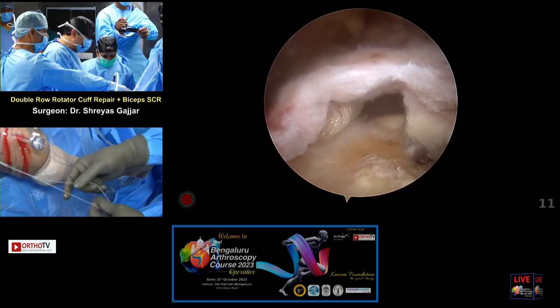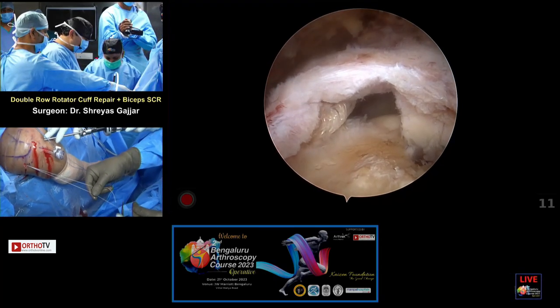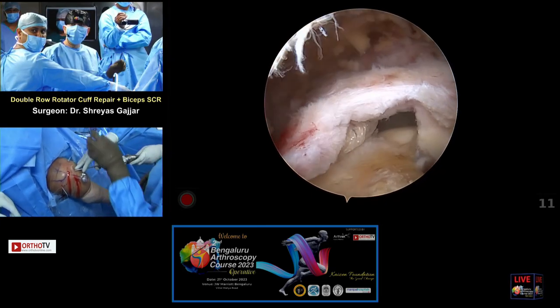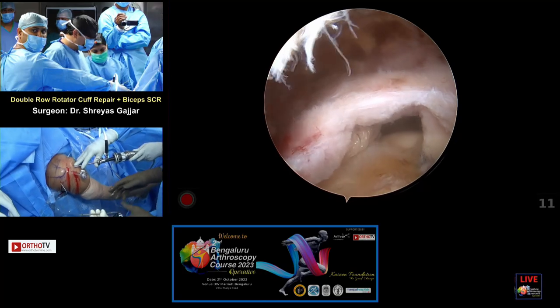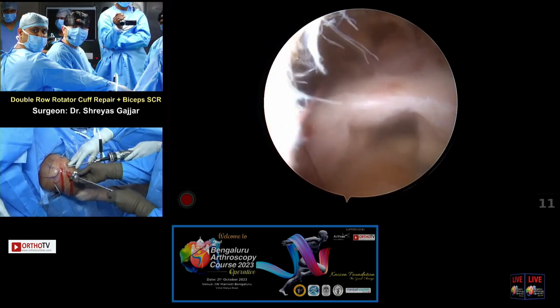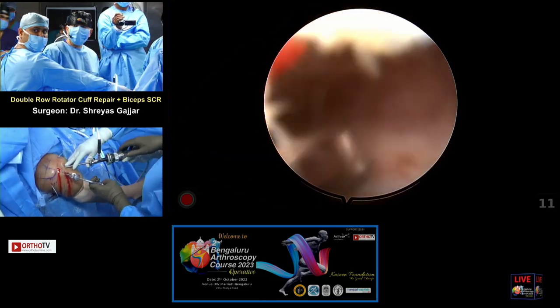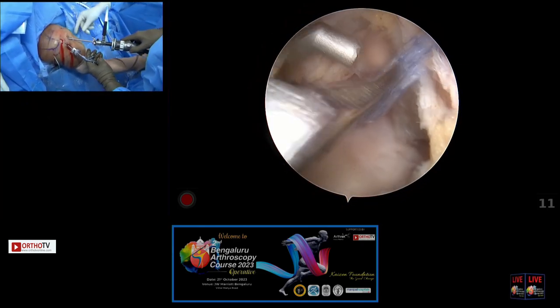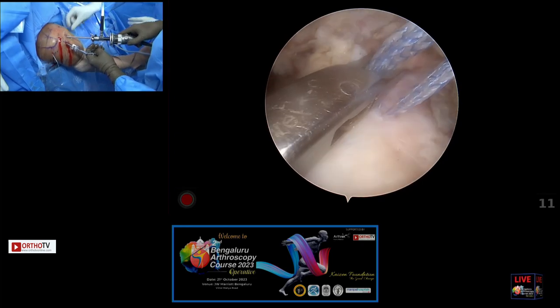Because now we need to tie the lateral rows. Okay, now can I have the tape retriever, please? So, take one tape. Cannula, please, Rohit. Hold the cannula, Akshay.